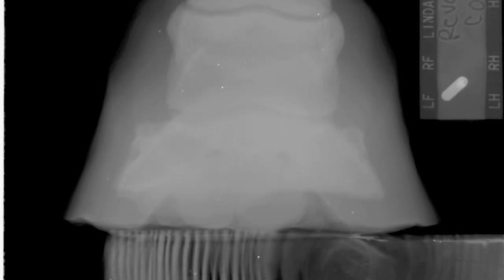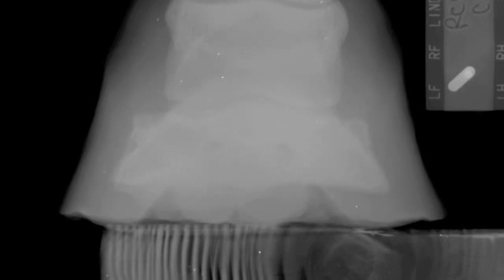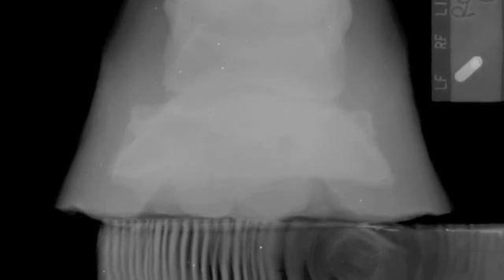I have a longer version of this, but I just don't have time to go into all the editing and everything. That part of the lateral foot with the fracture is actually adhered to the front of the hoof wall, like you initially suspected. The rest of it has kind of rotated down and prolapsed the sole on the medial side.